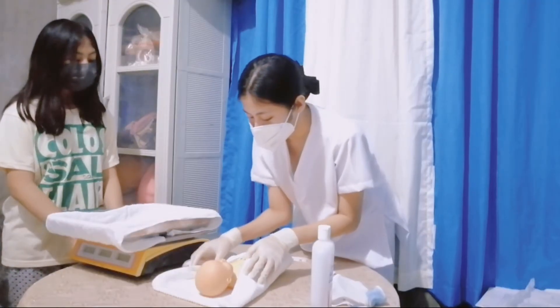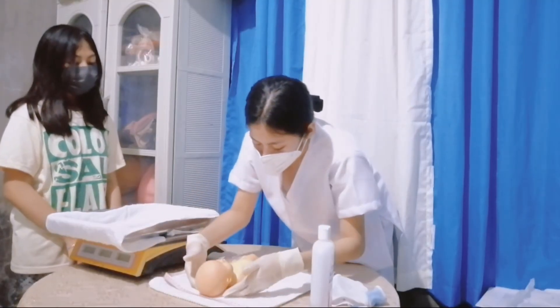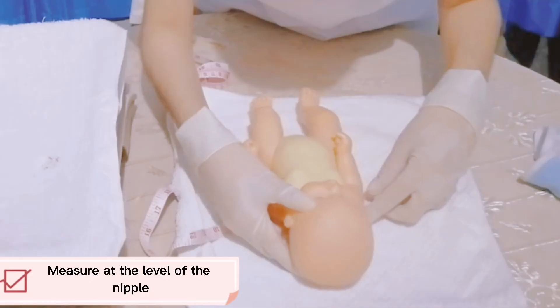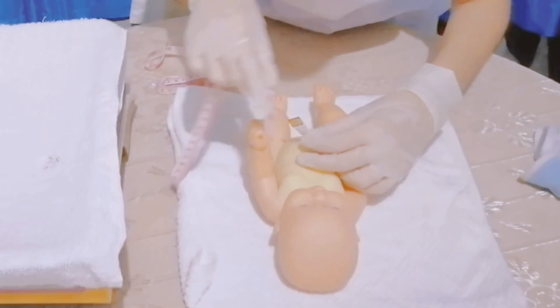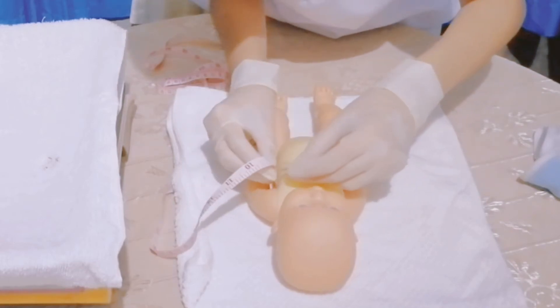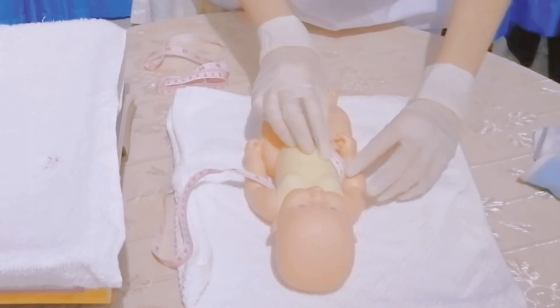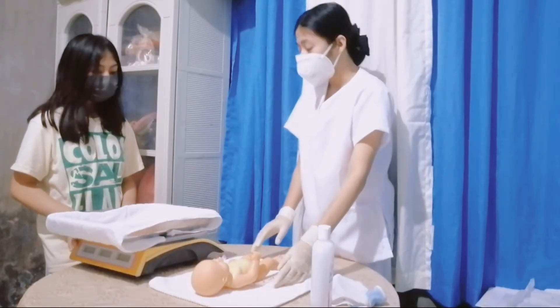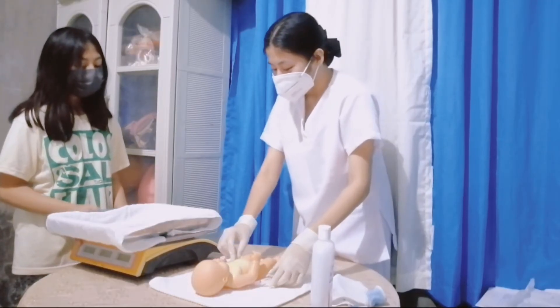Don't worry because your baby has a normal head circumference. Now we will proceed with measuring the baby's chest circumference. I will measure at the level of the nipple. The baby's chest circumference is 31 cm. The normal value for a chest circumference of a baby is within 30 to 33 cm. Therefore, your baby's chest circumference is within normal.